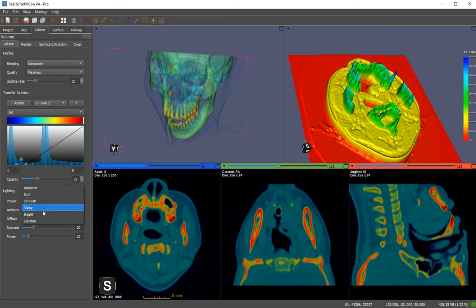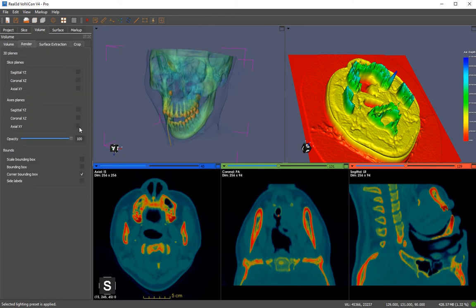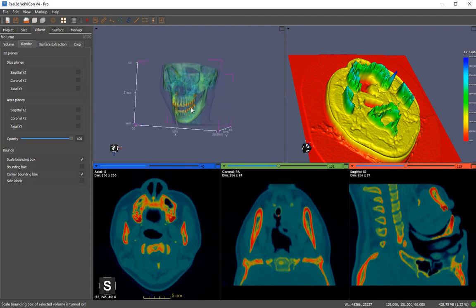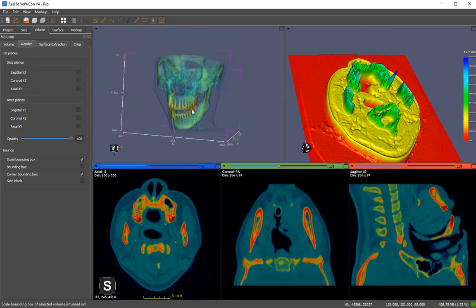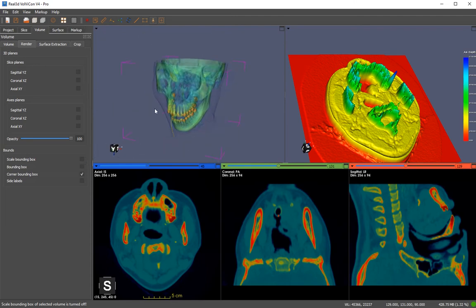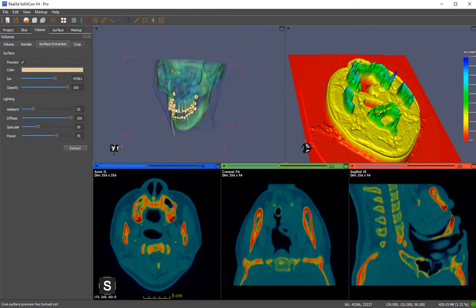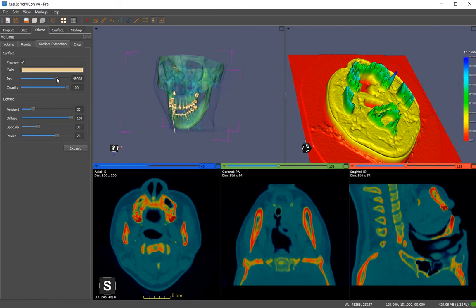You have a transfer function, and you can save it — all these settings will also be saved in the project file. You can enable or disable 3D planes from here as well.